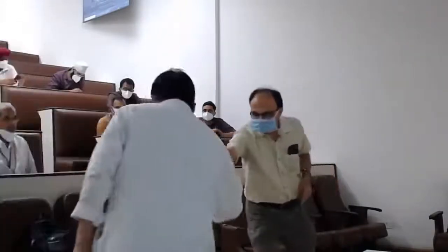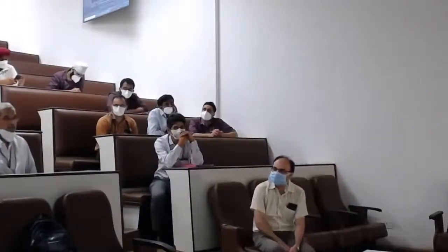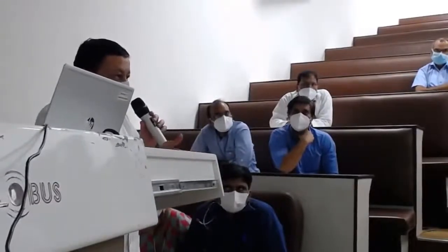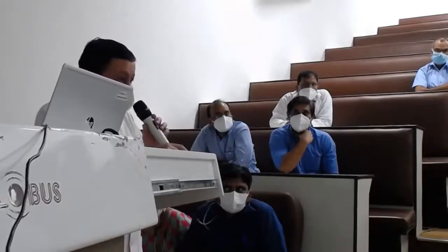After that, I'll give my two comments. So on the cost factors, the institute being highly subsidized, the machine is free for us. We are not charging anything for the machine. It cost us 70 lakhs, but we are using it for ILP and HIPEC. These are disposable kits, which are offered at 1 lakh. Then the temperature probes are supposed to be disposable, but we are reusing them like any other Indian center. They cost another 10,000 rupees.